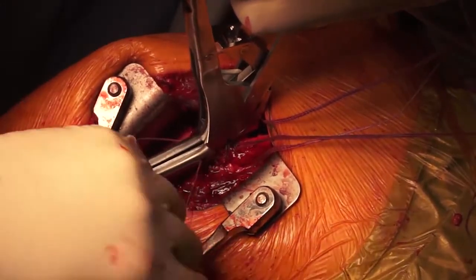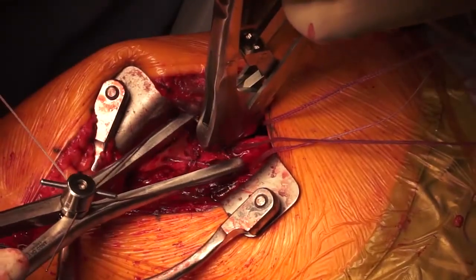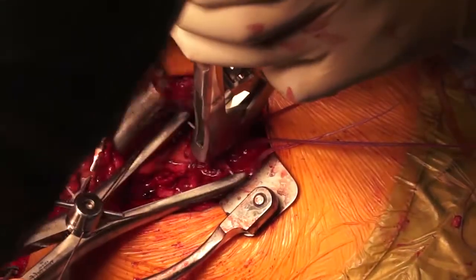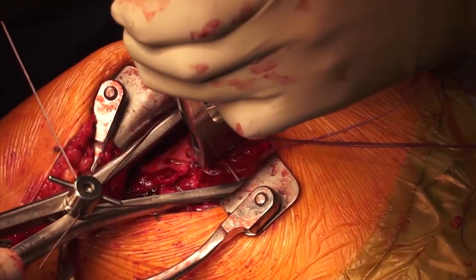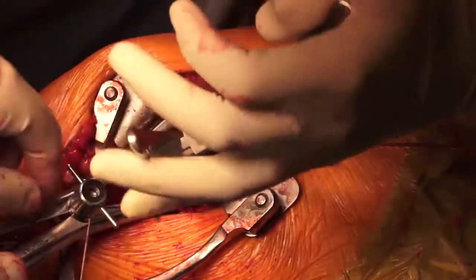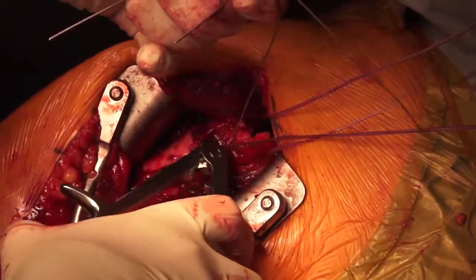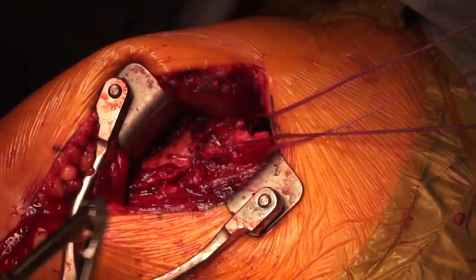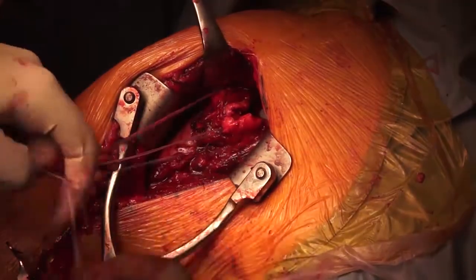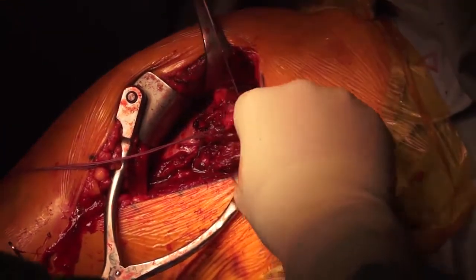With the tensioning instrument, the cable is tightened without deforming the tuberosities. A crimping instrument is used to fix the cable. The cranial sutures are tied to provide compression of the tuberosities against each other.